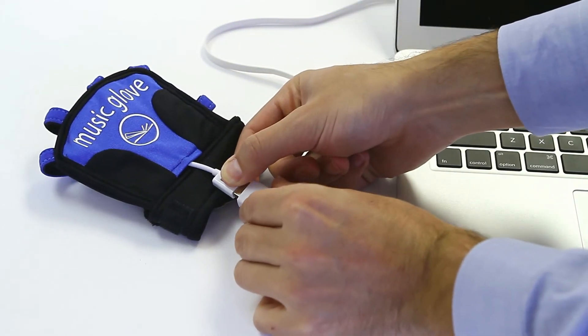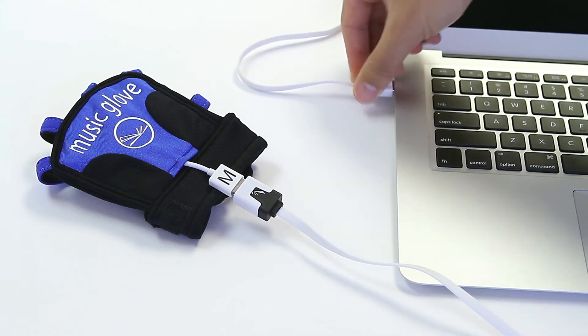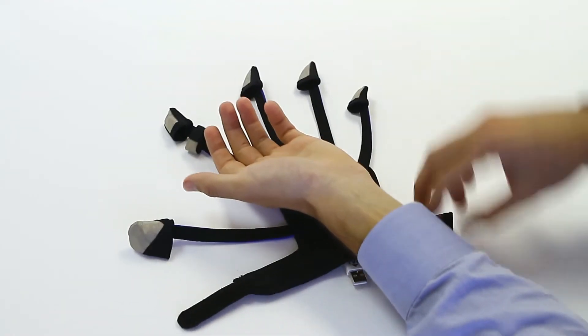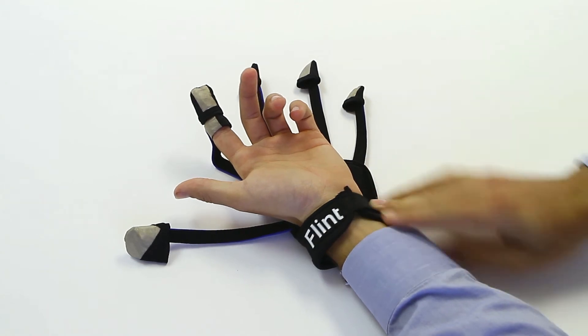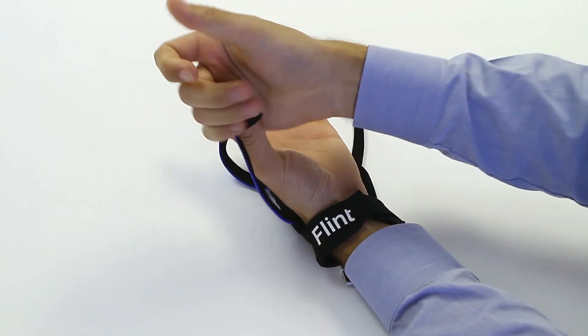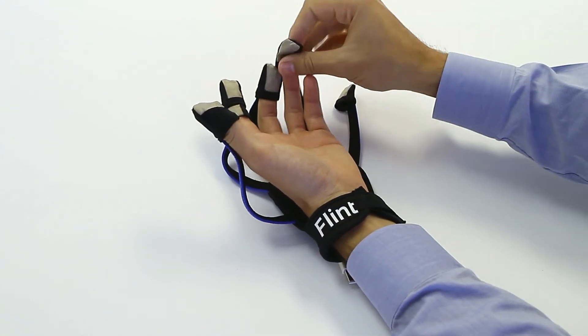Now plug the MusicGlove cable into the MusicGlove and plug the other end of the cable into the USB port on the side of the computer. Next, put on the glove. To do this, first slip the index loop over your index finger and pull down so it rests between your knuckles. Pull the index cot over the tip of your index finger, secure the strap around your wrist, then pull the thumb cot and the remaining other cots over your fingers.